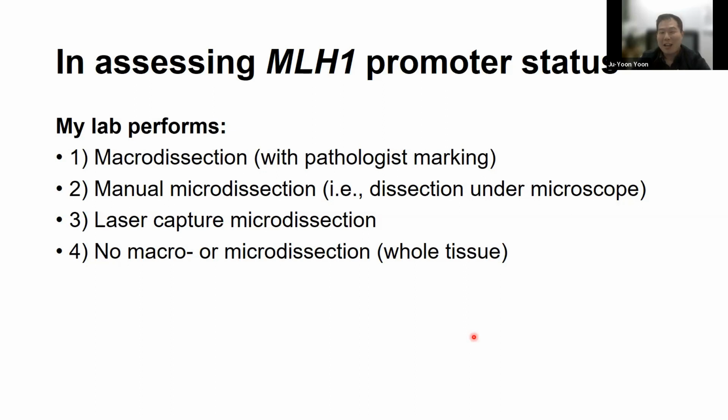Fair enough. I have done manual micro dissection in the clinical lab, and I used it when I was looking at molar pregnancies. I was trying to minimize maternal tissue contamination, so either myself or the technologist would dissect things under the microscope. With identity testing, maternal contamination can have a huge impact on some of those peaks. So that doesn't make it easier.